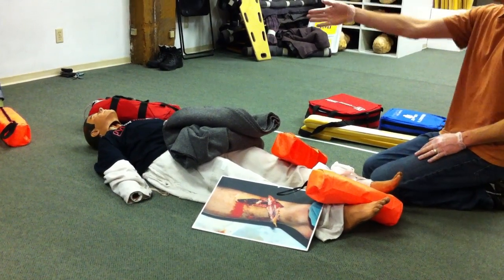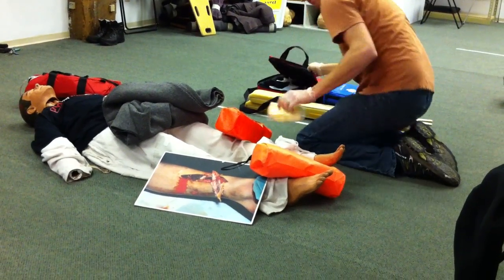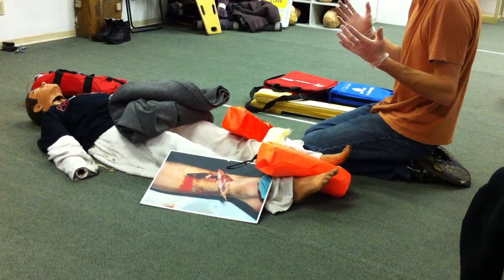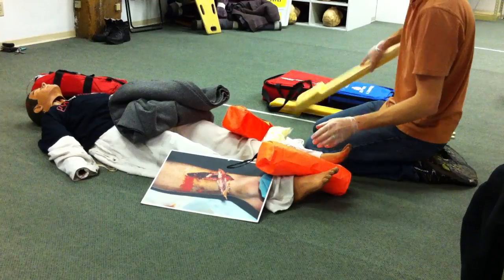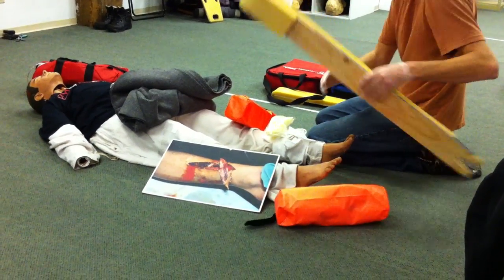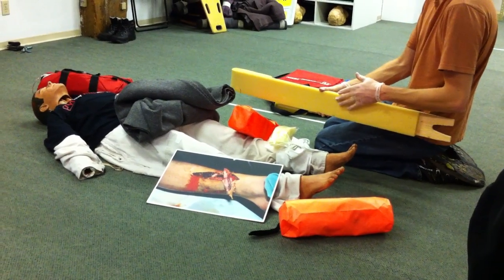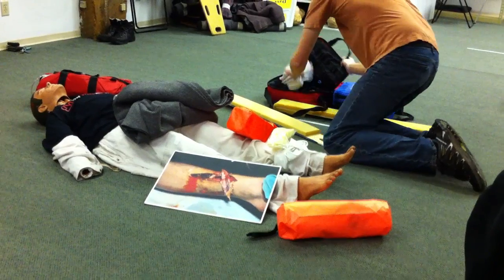Okay, so C is done, B is done, I. Let's get a little ice on here. Okay, and so then we're into splints, slings, and boards. Okay, so my splints, I'm going to get two of these. Again, helper's still here. One is going to go in here and one's going to go on the outside. And because I know that's where they go, I'm going to get my ties set up first, or my triangulars.